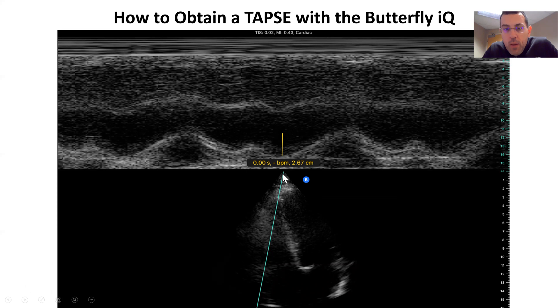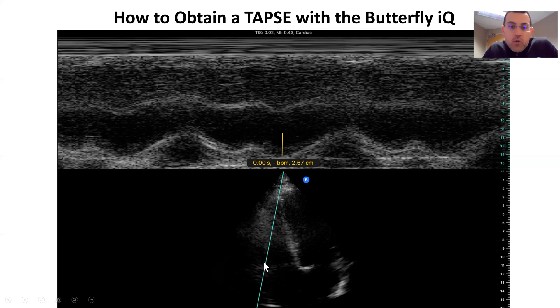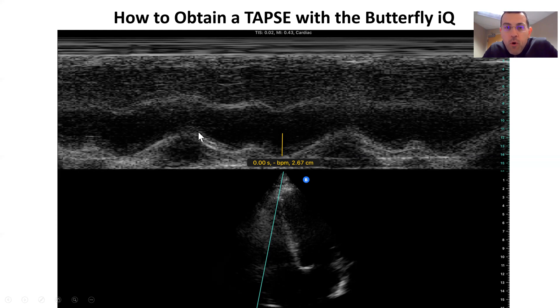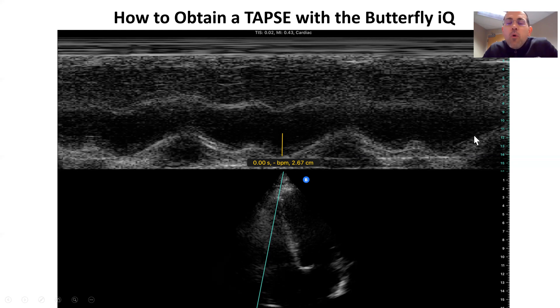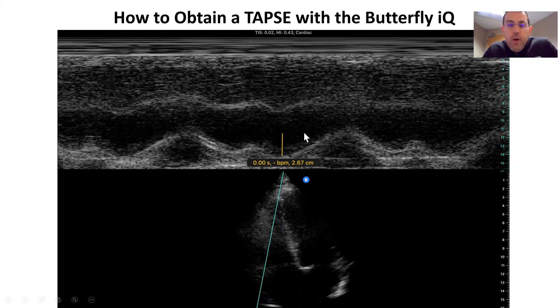Here we see our M-mode coming down, and what we do is put it right through the tricuspid annulus. That tricuspid annulus will be contracting toward and then relaxing away — toward and away. What we see here is that this goes toward the probe and then away, toward the probe and then away. We're interested in how well that right ventricle is contracting, so we're interested in the distance between the trough and the peak, and that tells us how well it's contracting.